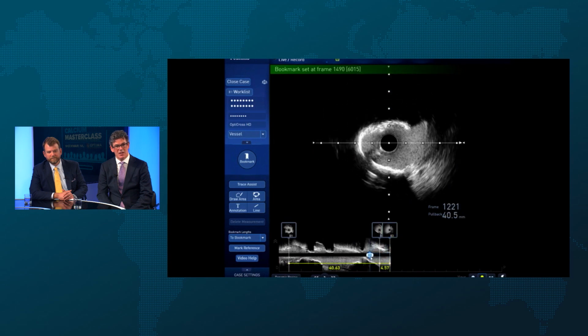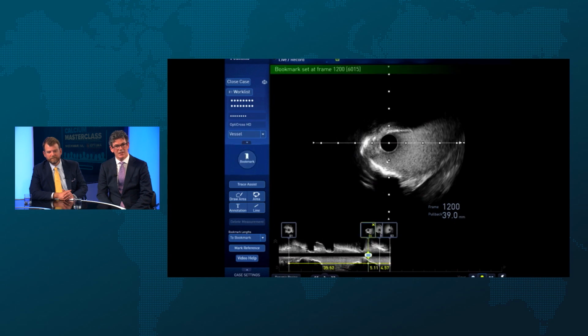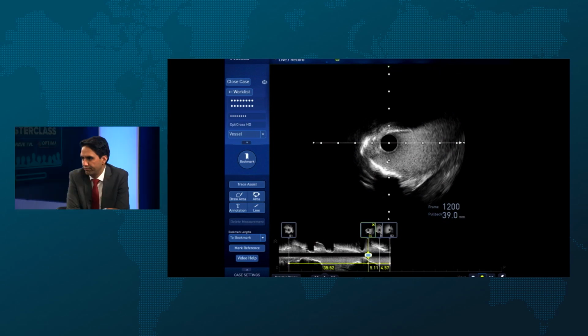You've got loads of space there, haven't you? Keep going, keep going. There's the circ there. I mean, there is distal left main, isn't there? I would use a 6 millimeter balloon if you have it for the POT here and be good. Yeah, we do.